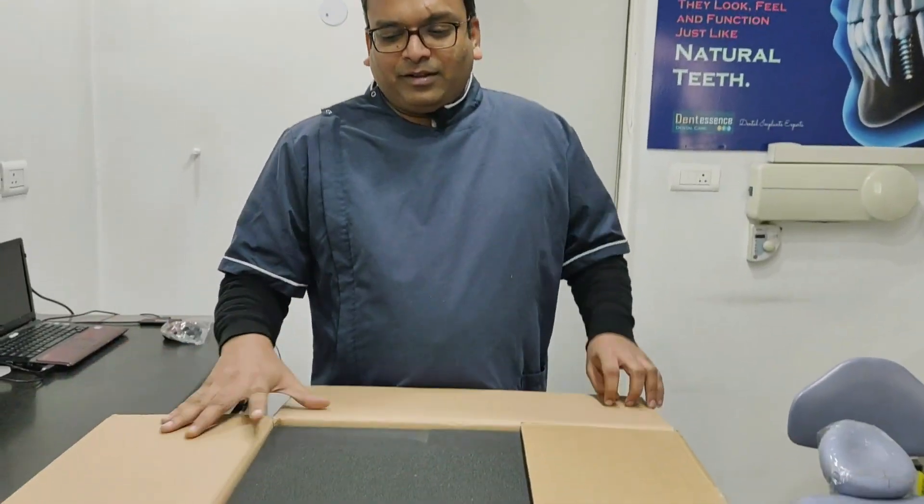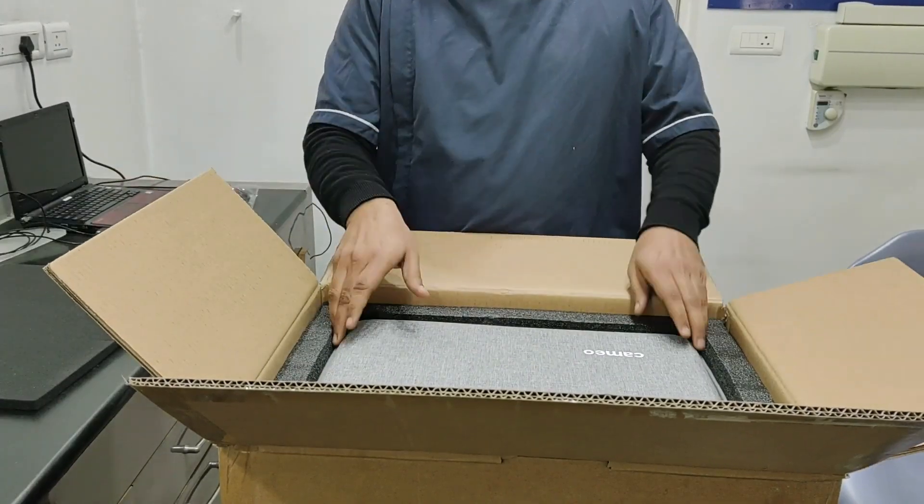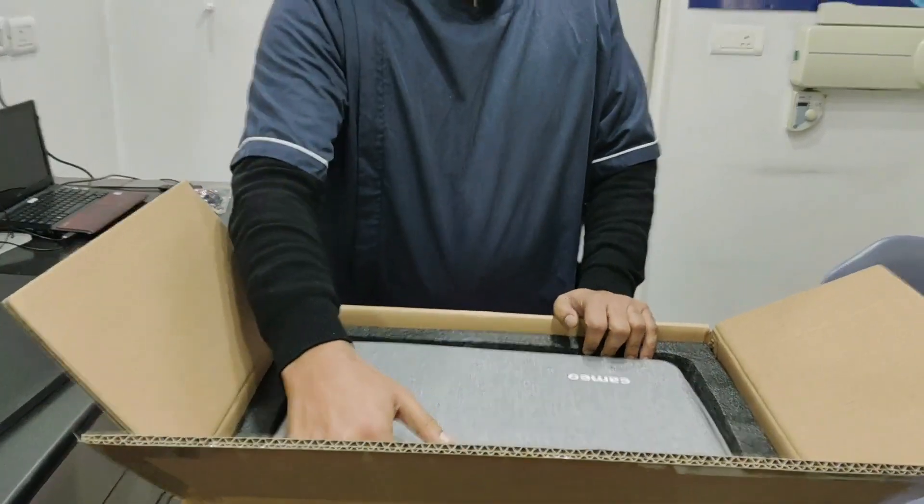Good morning friends! Today we are unboxing the new interval scanner from Cameo. We are very excited to have it in our clinic. Let's show you what all comes in the package.